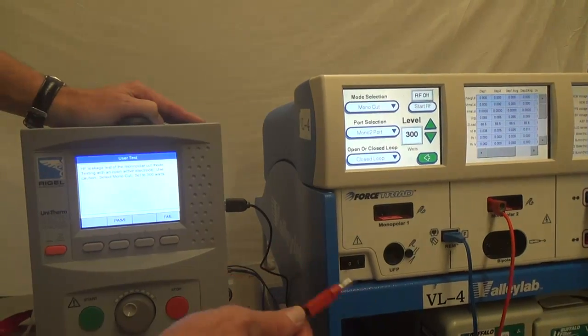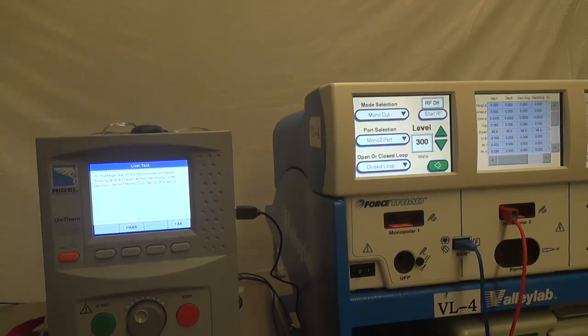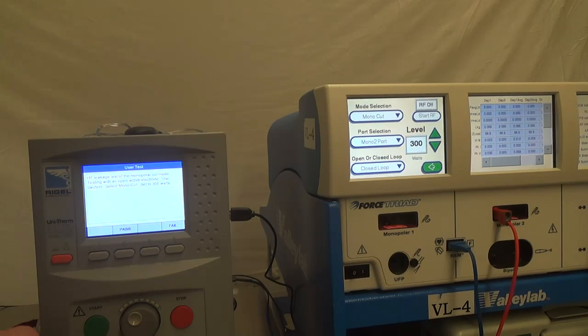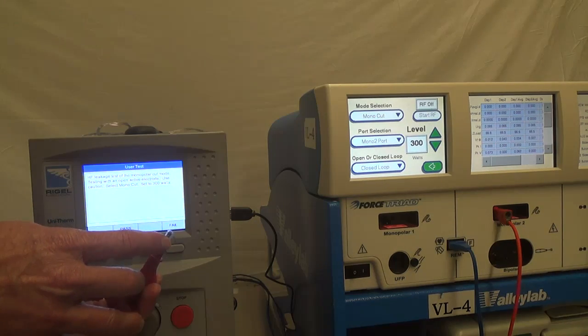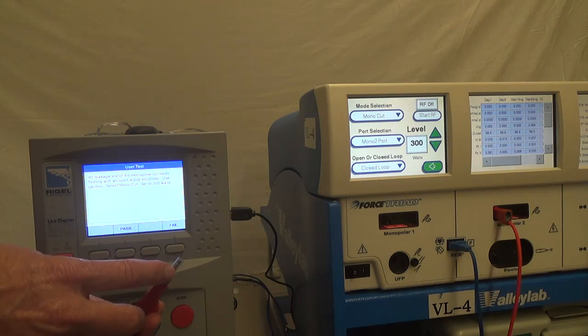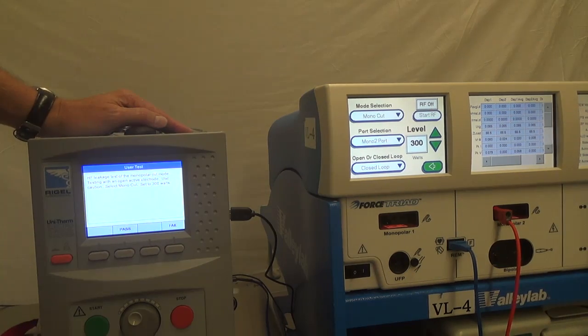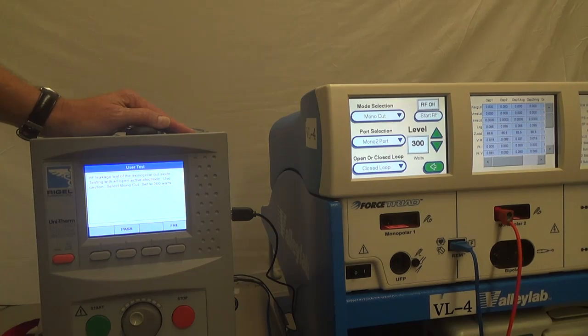The next test we do after this open active electrode will use an open dispersive or neutral. So it's very important. This is why I really like to use this shielded banana pin plug. If you do not use this, make sure that that connector does not touch the ground or a conductive surface. Make sure it does not touch your fingers.